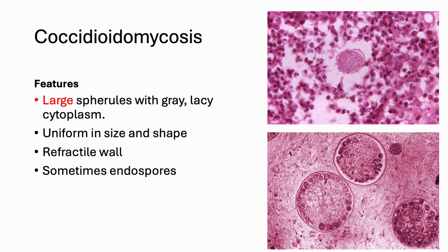The wall is refractile, so it is easy to differentiate this microorganism from other deep fungal infections because of the unique large morphology. You will not miss this.